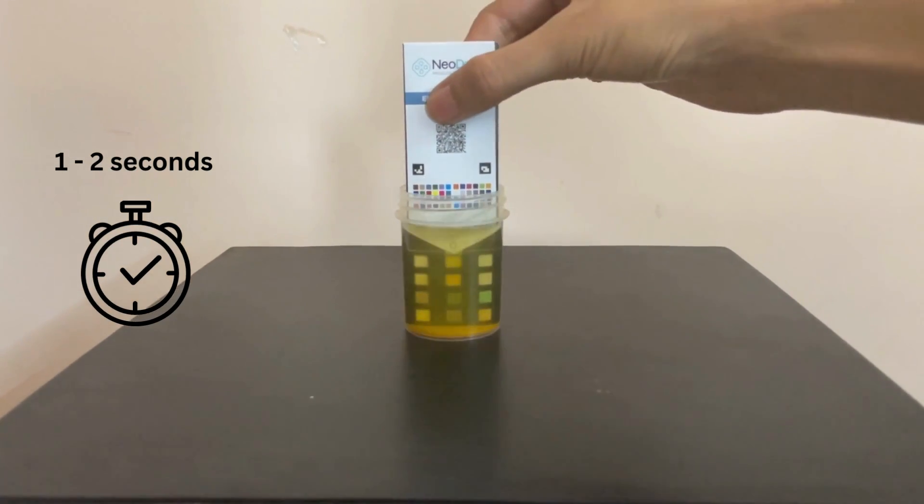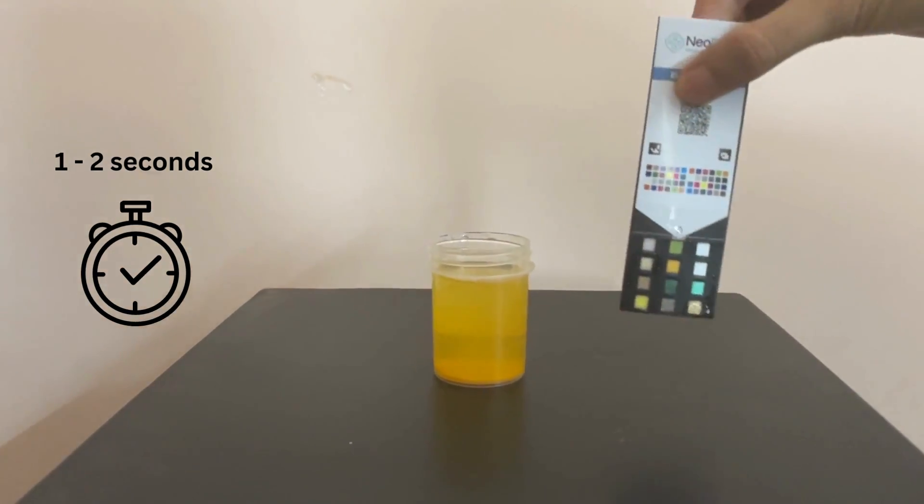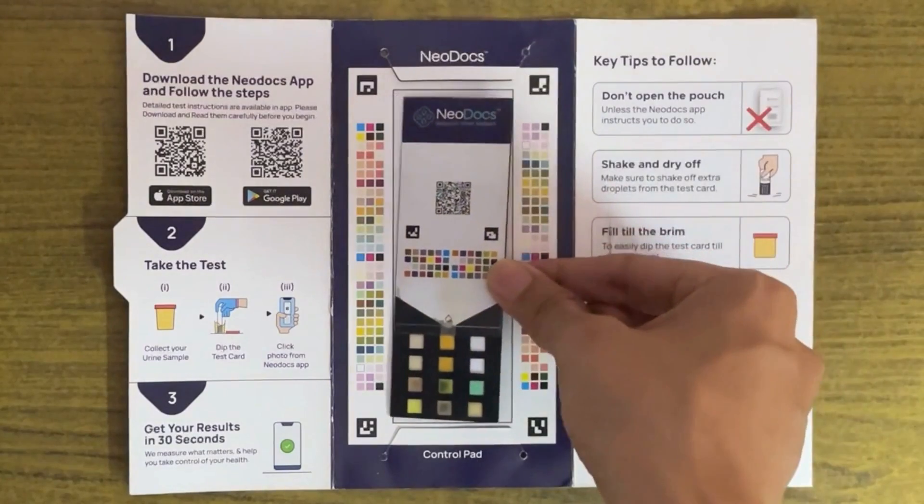Dip the test card in the urine sample for 1 to 2 seconds. Take it out and shake it lightly, then place the dipped test card on the control pad.